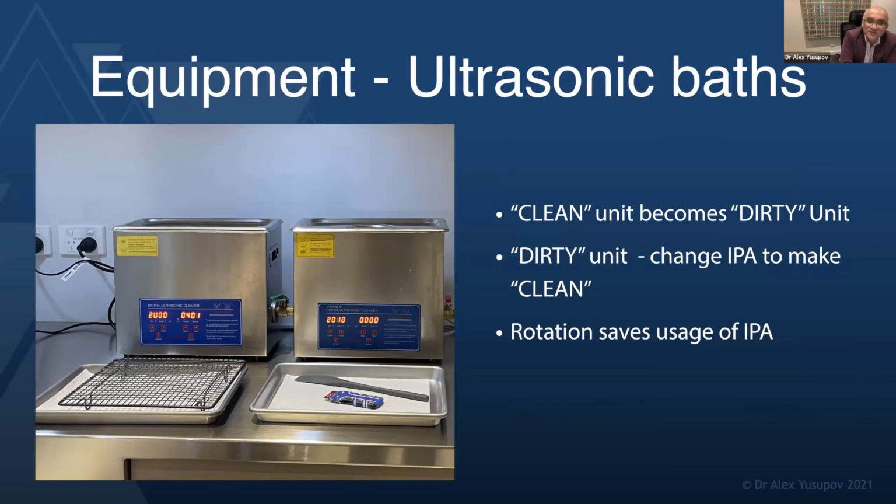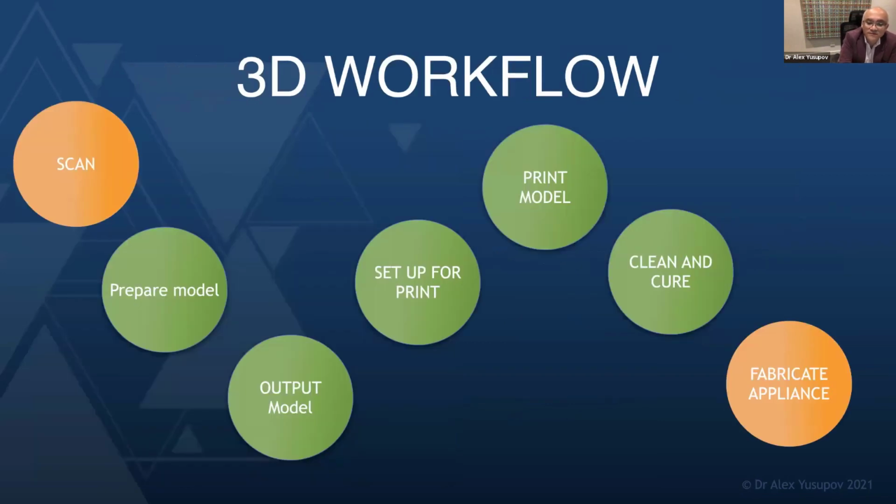So it's been my pleasure to take you through our 3D workflow. I hope you found it informative. I think I'm 4 minutes over time. This was an hour and a half lecture before this. I'm really, really grateful for the opportunity to share some of the stuff that we're doing and some of the processes that we've put in. Thank you so much.